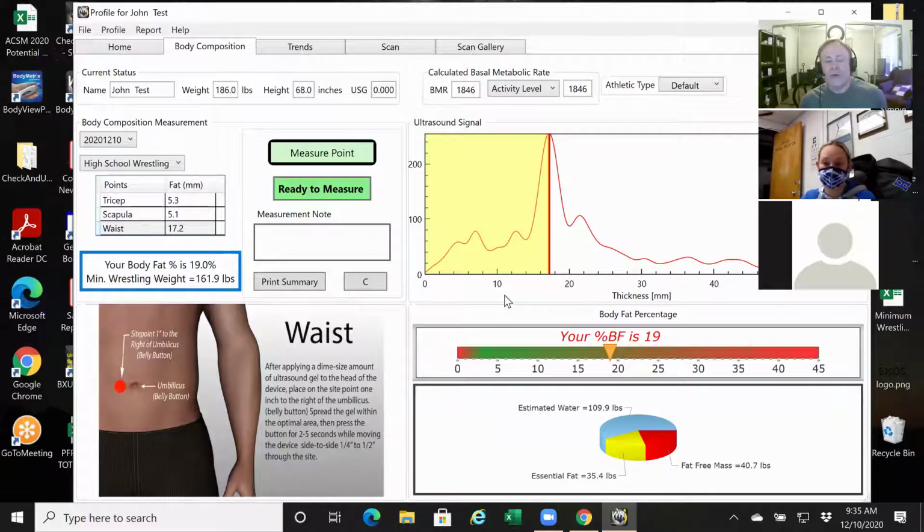Now, I want to give you a couple of other tips and then give you an outlier situation that came up with an assessor recently. And it's really more when you're considering an athlete that has excessive abdominal adipose here. They've got a roll. Those kids are probably going to exceed 25 on the scale. I like to use 25 as a good mental reference, and here's why.